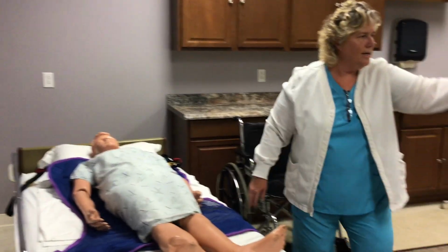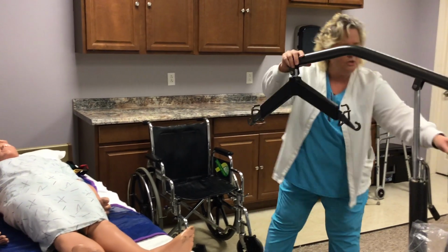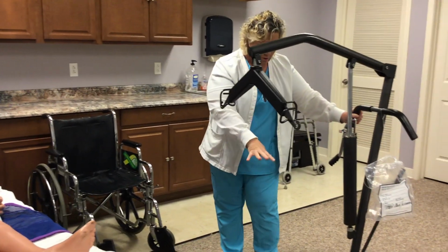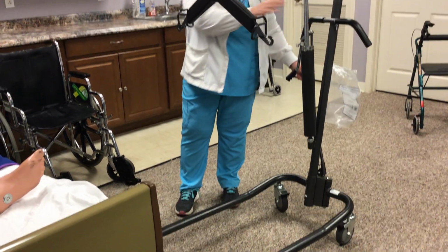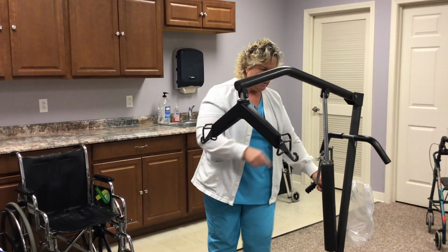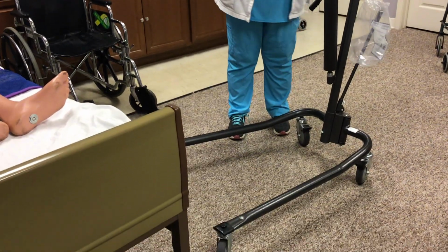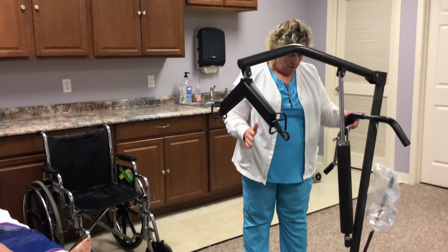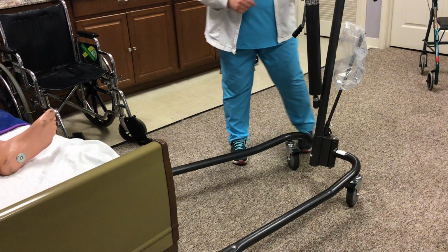Now I'm going to bring the lift so that you can see it. You've got an arm up here with the hooks, you've got legs. Most important thing in this whole video is that these legs down here are separated. You've got a wide base. That is what keeps the person from tipping over. You also have locks on the wheels, which we'll use in a little bit.